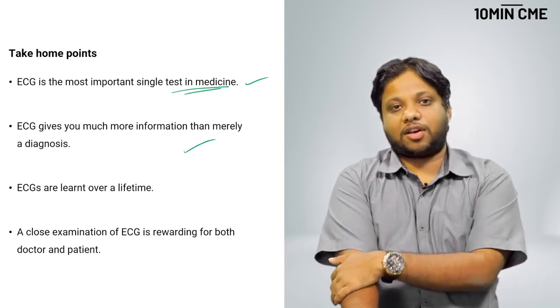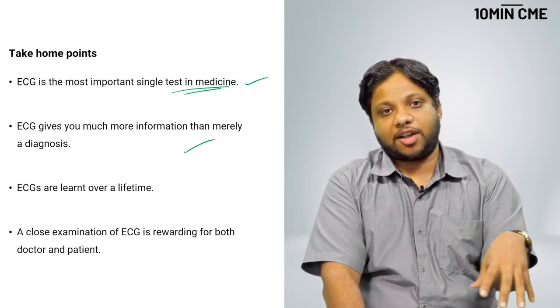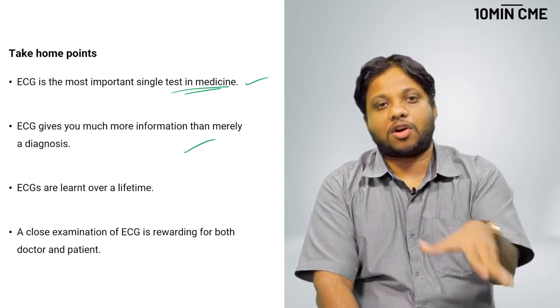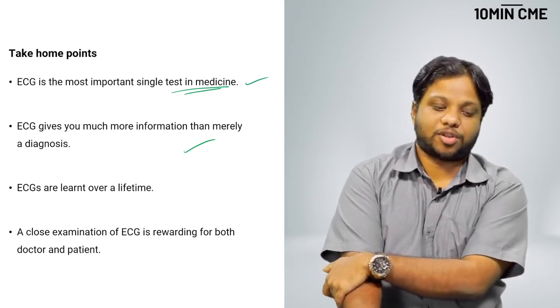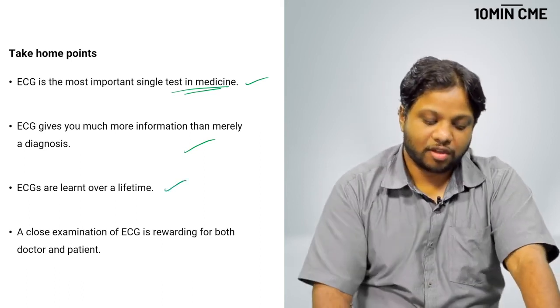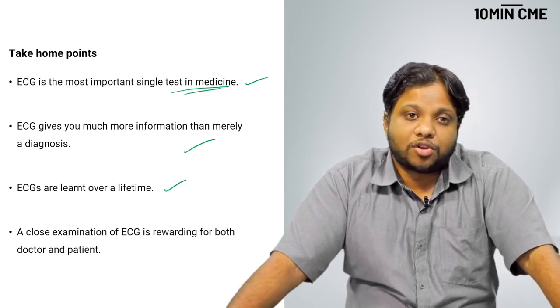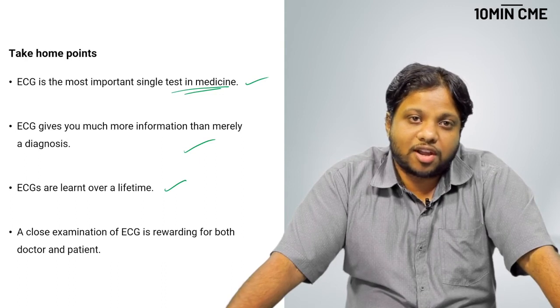This is very important. The same ECG can be interpreted differently by a house surgeon, by an MD, by a DM, or even a person who has done his electrophysiology fellowship. So, ECGs are learnt over a lifetime. A close examination of the ECG is rewarding for both doctor as well as patient. So, put your efforts and time into learning ECGs, you will automatically save a life.